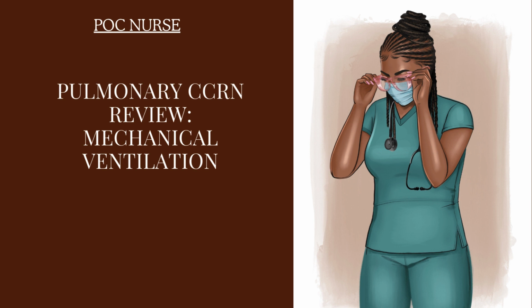It's important to note that for patients with ARDS requiring high PEEP, if they get disconnected from the ventilator, we could lose the alveoli that had been recruited for gas exchange and more efficient ventilation, because once the patient is disconnected, we lose that high PEEP, because now we are ventilating the patient by hand. So it may be difficult to get this patient's O2 sat up just by bagging the patient.